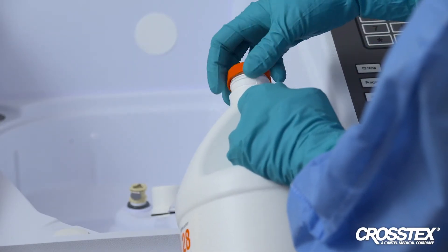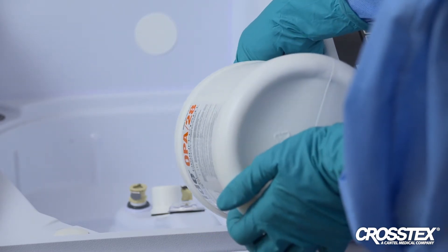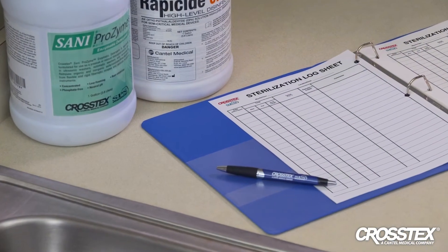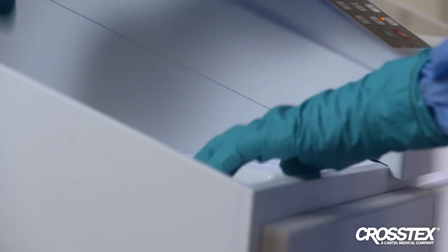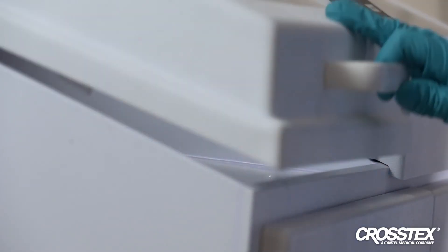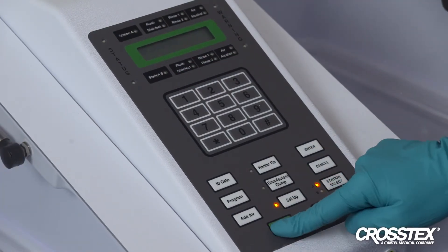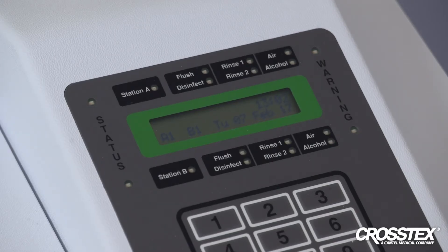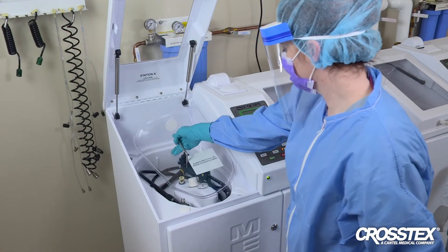After MRC testing is complete, fill the AER with the Rapicide OPA28 HLD solution. Be sure to refer to the daily preventive maintenance check sheet for day-to-day preventive maintenance. To run the reprocessing cycle, close the lid and secure it, then select the appropriate cycle and select start to begin. Perform the automated disinfection cycle in accordance with the AER manufacturer's IFU. Be sure to select a cycle validated for use with OPA-based disinfectants and the scope manufacturer's IFU. When the cycle is complete, verify that the stop LED is illuminated before opening the lid and removing the scope.